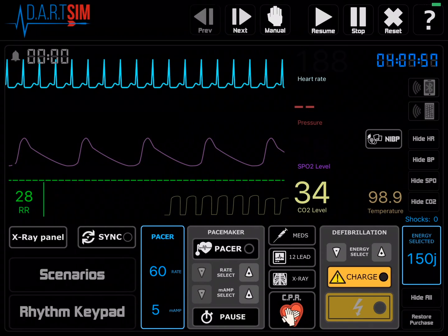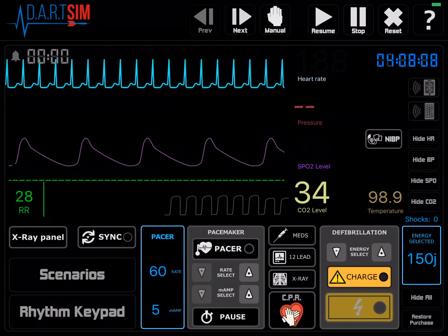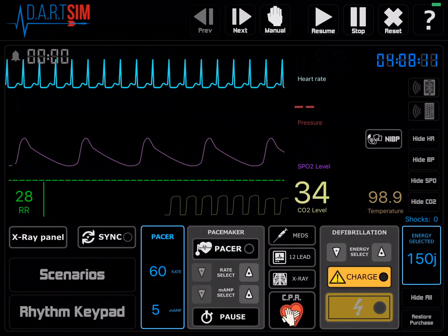To start, you'll notice that you can see LEAD2 at the top. Just below that there's an SpO2 waveform, and below that there is an ETCO2 waveform. You'll also notice there is an ETCO2 readout to the right, and all the way on the left in the green there's a respiratory rate.